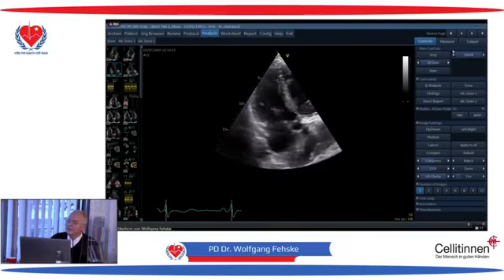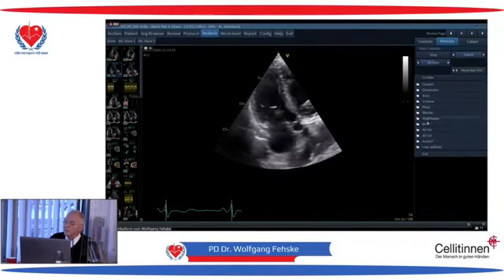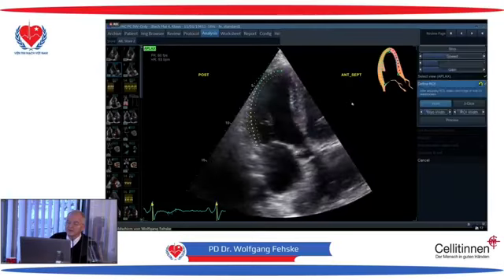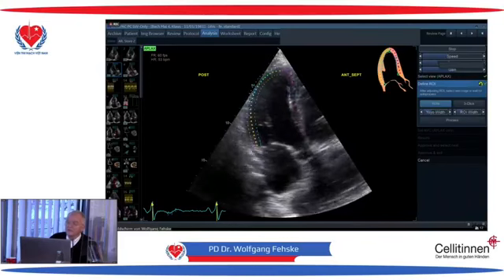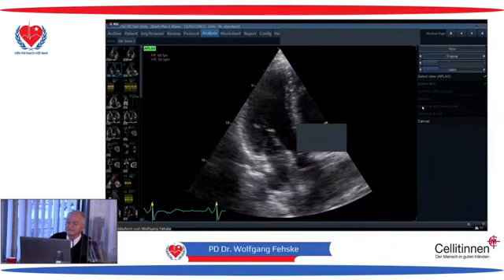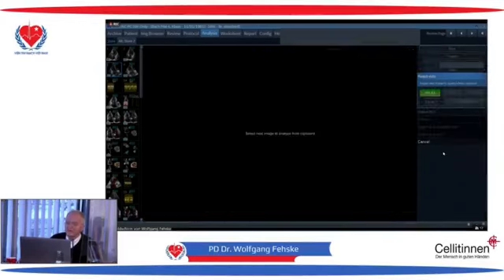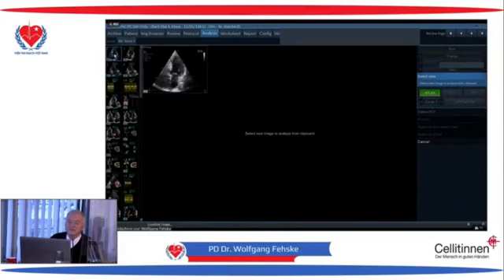What we do then in this patient afterwards for analysis is, you all know that, or just a minute, I have to put that a little bit wrong. Sorry. For measuring, we take the AFI, and then we do it very fast. Something is wrong with the computer. I do not know what happens now, but could you ask the technician? I select the next. Next is a 4-chamber view.